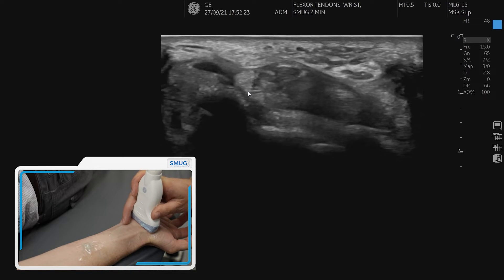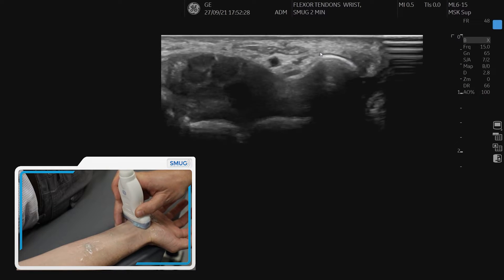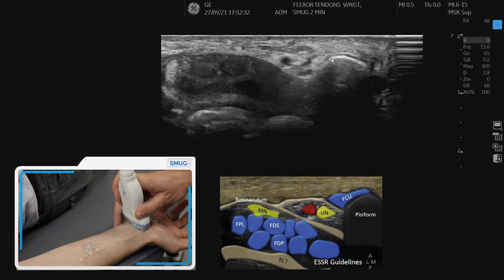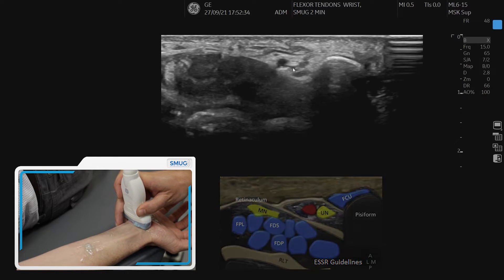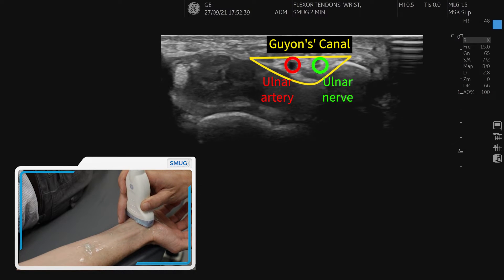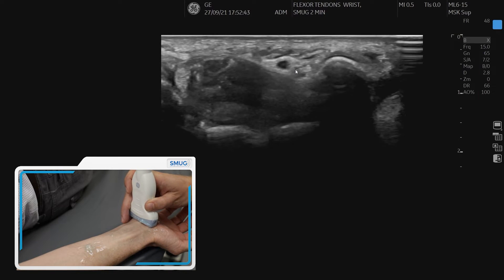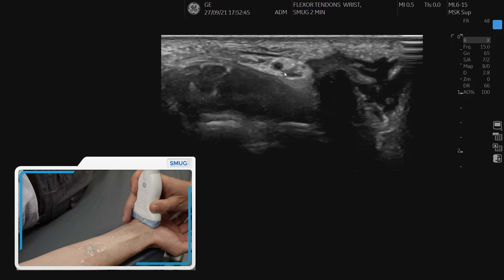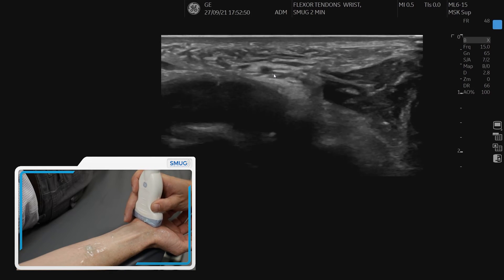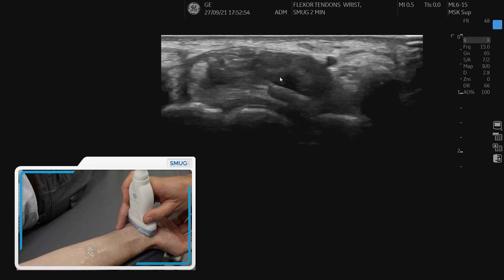Going back up, the next structure we are going to look at is this little triangle here, which is Guyon's canal. This is the pisiform; we can see the ulnar artery and also just see the ulnar nerve. If we are really light with our pressure, a little vein pops out. We can follow it down and the ulnar nerve will split just above the hook of hamate, which we can see there. Those are all the structures within the flexor region of the wrist.